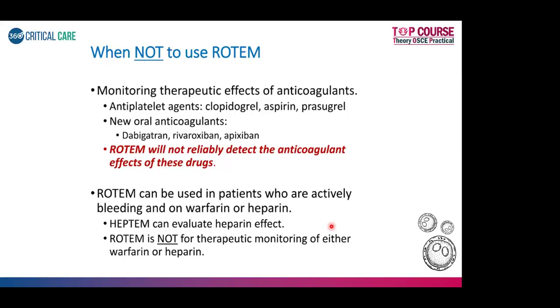Excellent. Both the answers are correct. One of you said temperature, one of you said calcium. Both are taken as normal here. It does the test at 37 degrees Celsius and will not account for any issues with calcium. So if you have corrected all of these parameters and your patient is still bleeding, think of these two as the reasons. Even then, if it is bleeding, think about what else: von Willebrand factor deficiency, and that's where DDAVP comes into the picture.